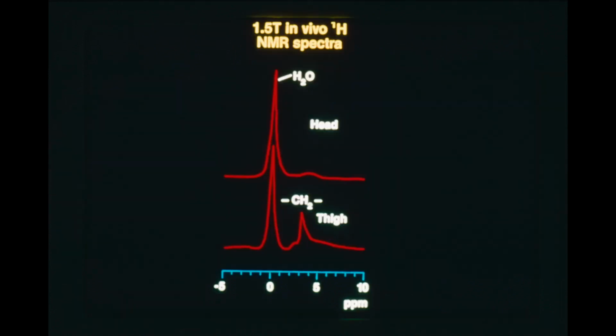Showing as an example, here we are in the head and the thigh. Yes, we can see some lipids in the thigh, but we're also picking up water from the muscle. This is more from the outside. The real question became, how do we begin to localize this information?